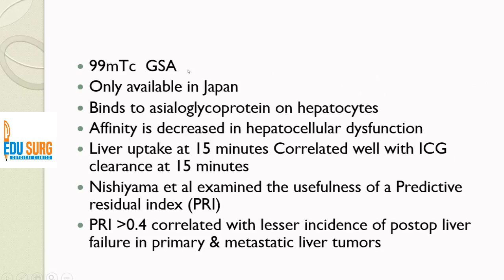Like I said, the other radiopharmaceutical, galactosyl serum albumin, is available in Japan only. It binds to the asialoglycoprotein receptors on the hepatocytes. As the hepatocellular function deteriorates, the affinity for this radiopharmaceutical decreases.